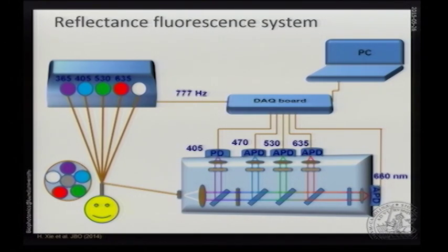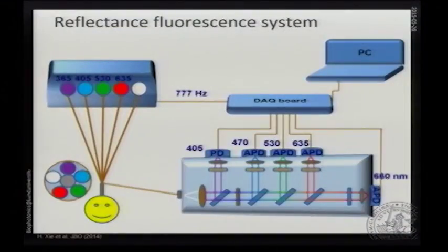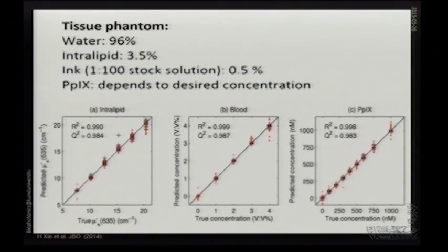And the other idea with this, as I said, is that we would like to get rid of the ambient light. This we can do by modulating at quite a high repetition rate and having some type of lock-in detection. So we measure both on and off all the time. That means we can subtract the background very efficiently, at almost 1 kilohertz rep rate. So that provides us with a very good suppression of background light.